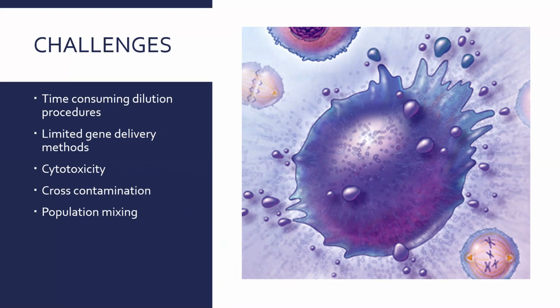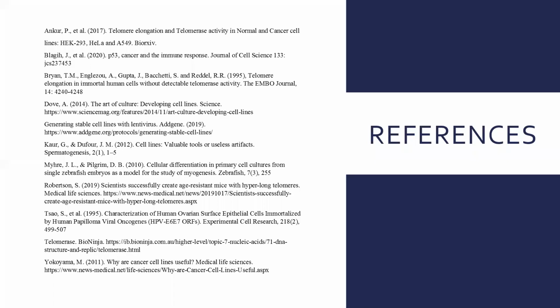However, even with these challenges in mind, immortalized cell lines can exhibit properties including higher proliferation rates, plating efficiency, and saturation density. The establishment of a continuous line of cells can provide an in vitro model for the study of carcinogenesis in human cancers.